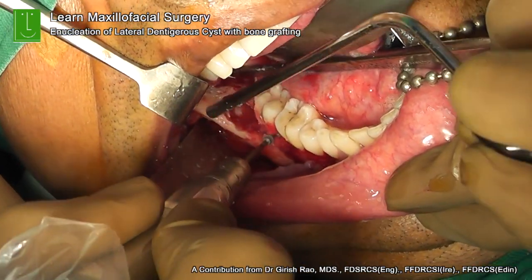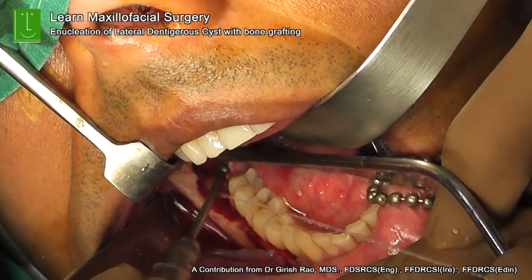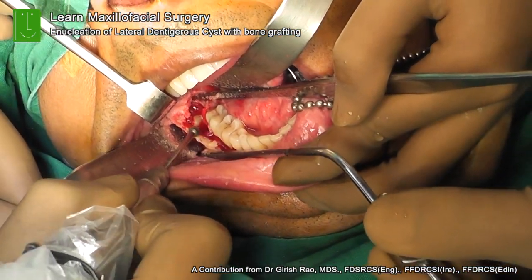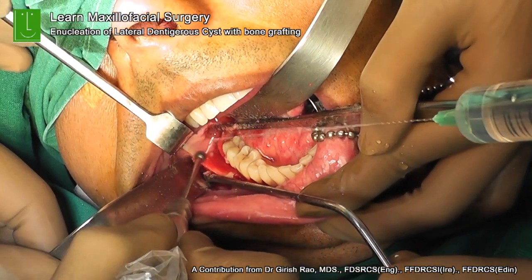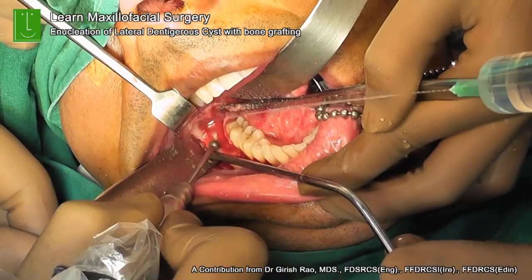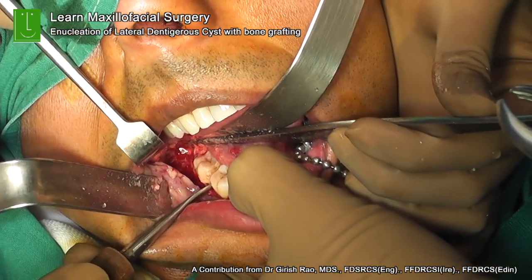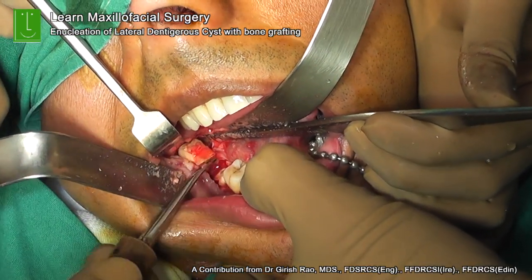With a fine round burr, you need to basically remove a significant amount of bone to get into the cyst. And once you've done that, then you can change to a rosette surgical burr, which trims the bone, and we are trimming the buccal cortical bone over there. Guttering around the second molar is usually done so that a very minimal amount of trauma is created when you're elevating and luxating the second molar.